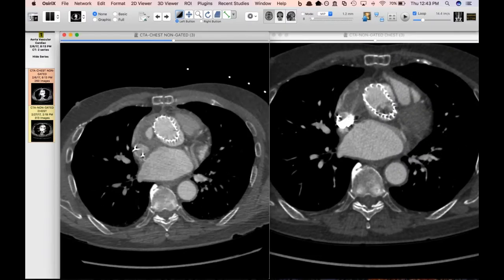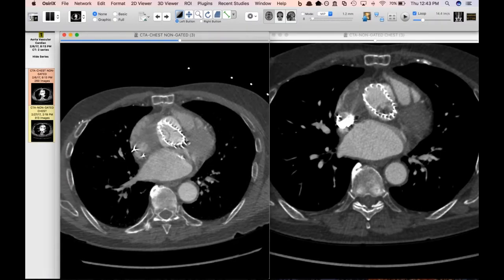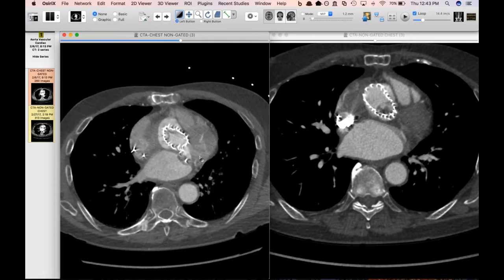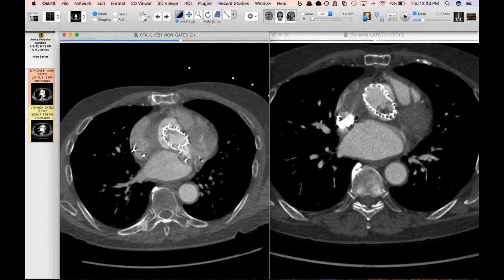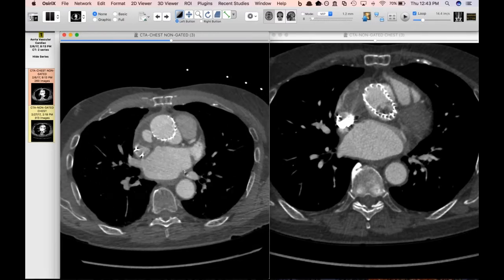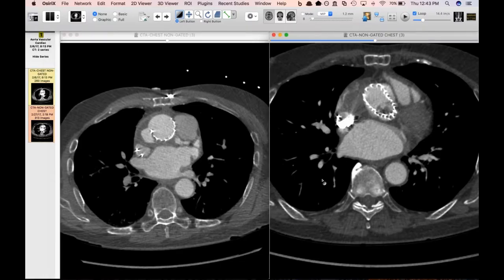But as I was scrolling down through, I noticed this — which was new. This is like the case that Brent showed recently of thrombus associated with the TAVR. You can see it along both the left coronary cusp and along the non-coronary cusp. The non-coronary sinus portion outside the stent really has a lot of thrombus in it too. That New England Journal article reported a significant incidence of restricted valve leaflet motion and thrombus in these patients — most responded to anticoagulation. But of course, he's a management dilemma because he has a contraindication to anticoagulation given the pseudoaneurysm, but you probably want to anticoagulate to prevent embolic stroke. They did admit him and are cautiously anticoagulating him.